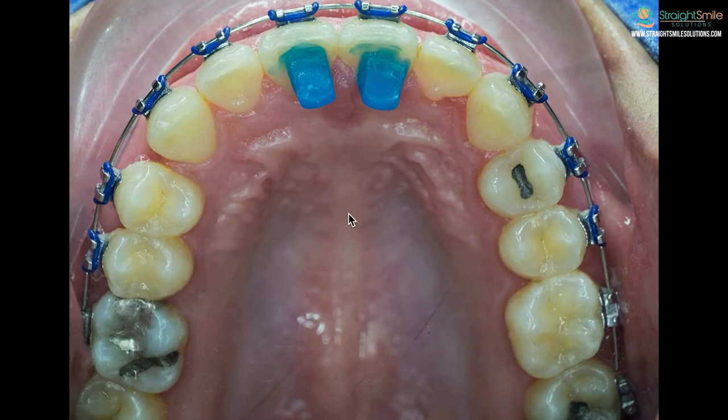I'm Amanda from Straight Smile Solutions and today we're going to be talking about bite turbos or bite bumps. We're going to be talking about these because a lot of people are getting these with their braces and not understanding what they're for.